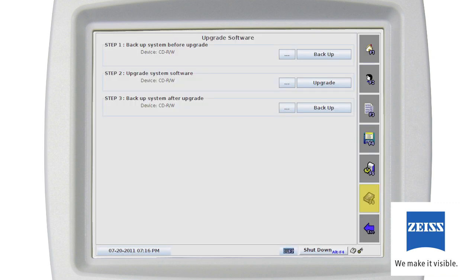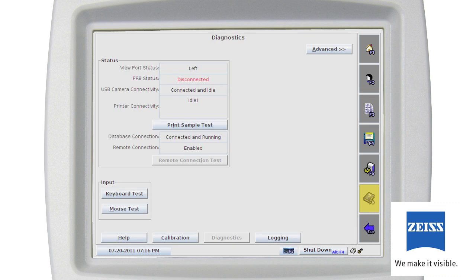The install software function integrates the software upgrade procedure with pre and post backup functions to help ensure a safe and complete upgrade process. The diagnostic screen provides basic information regarding the operational status of the Humphrey Matrix instrument, and is useful if you are experiencing problems. Problem areas are indicated by different color text. For example, red text indicates the patient response button has been disconnected. If the button is properly connected, customer care can assist you further in diagnosing the problem.